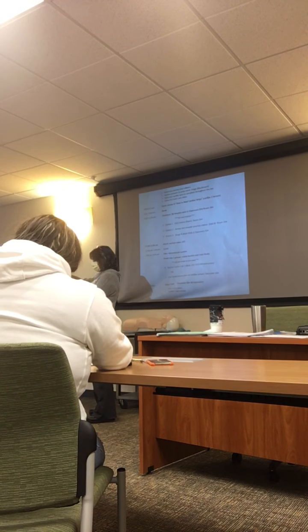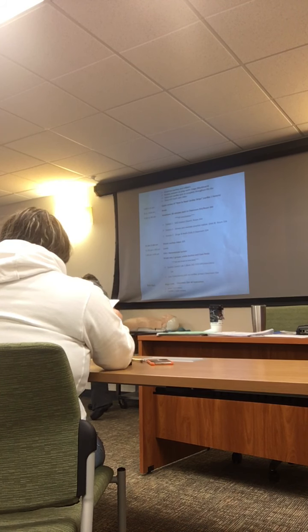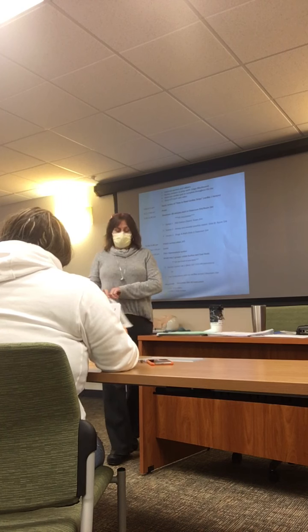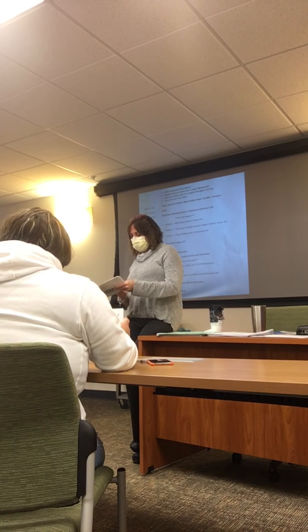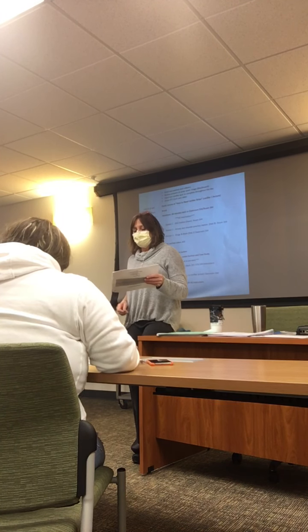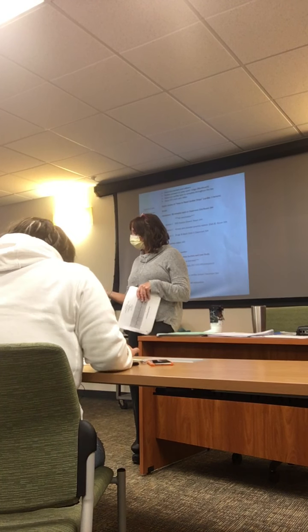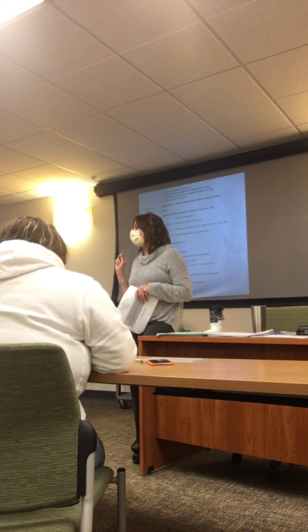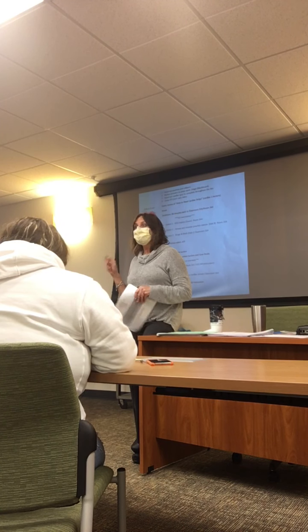The next rhythm is sinus bradycardia. And sinus bradycardia has all the characteristics of normal sinus rhythm, except it's a bradycardic rate. It's slower than what? 60.